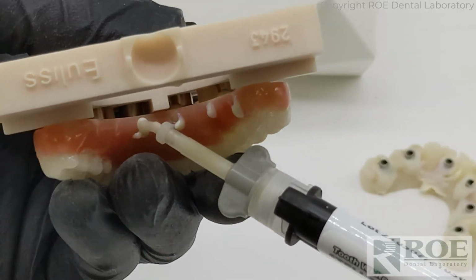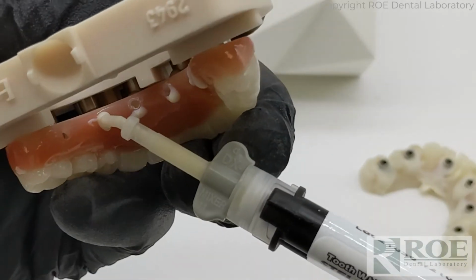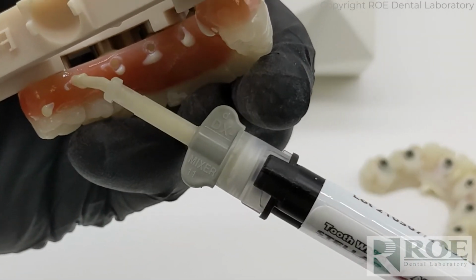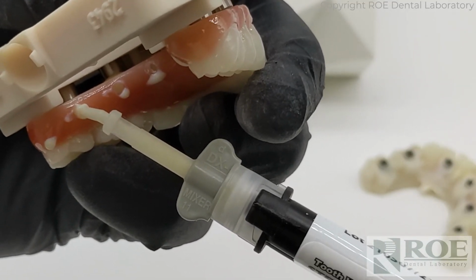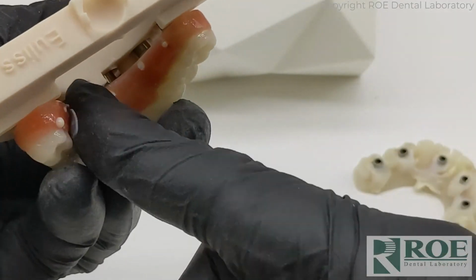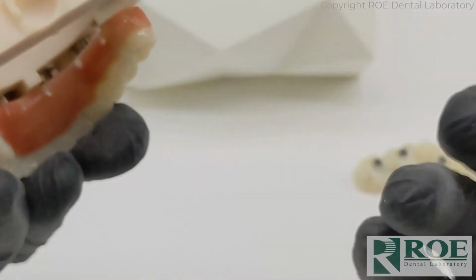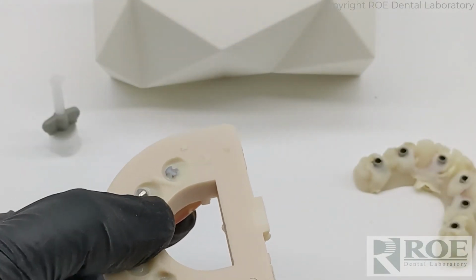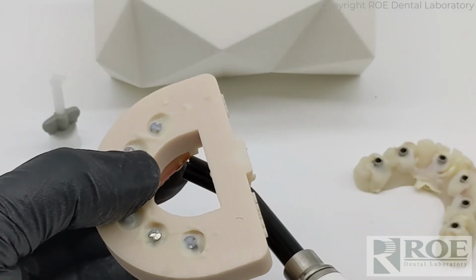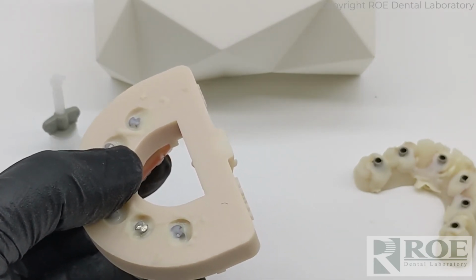Because we know we have some on the labial. We're just introducing on the lingual. So we know we're going to grab the coping. Okay, there we go. Hopefully you can see that, but you can visually see the material filling the well and kind of grabbing that coping. And then with a finger, just wipe this away. You don't want to have to grind it later with a burr. There we are. Okay, and now we let it set. We'll hit it with a light, and we'll light cure by the ports, and a little bit of light will go over the top, and then you are locked in and you have your prosthetic converted.